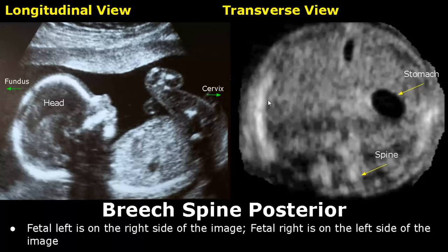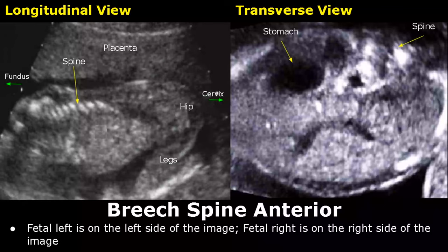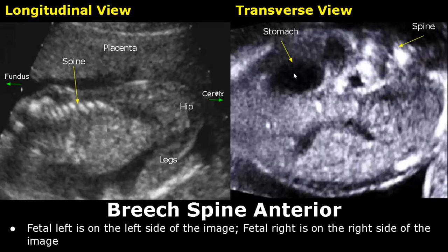In the breech spine anterior orientation, the spine is seen on the upper side of the image. The fetal left is on the left side of the image — that is why the stomach is also seen on the left side. And fetal right is seen on the right side of the image.